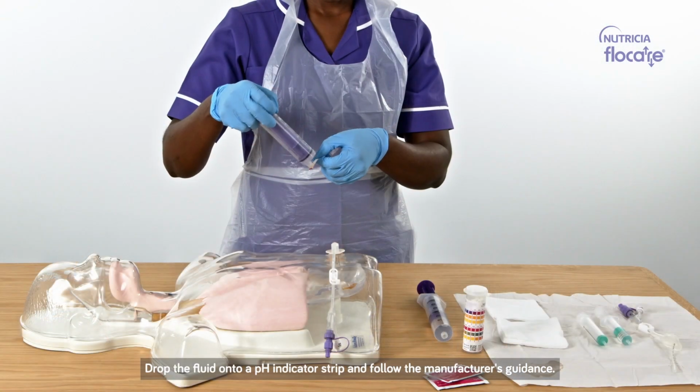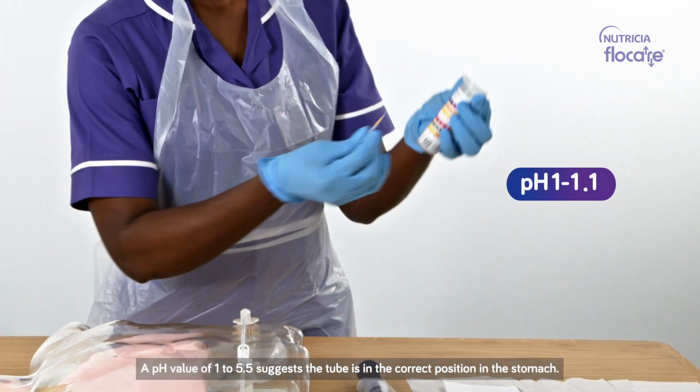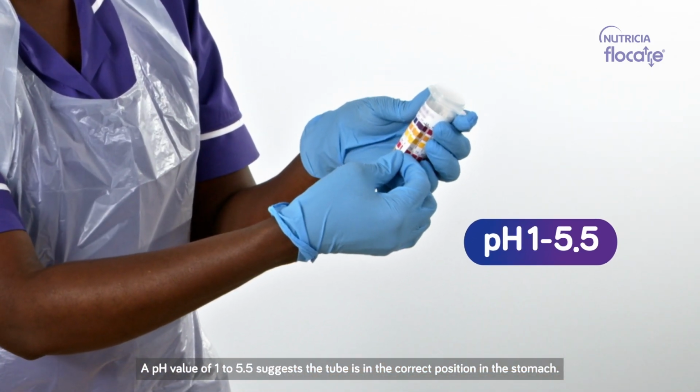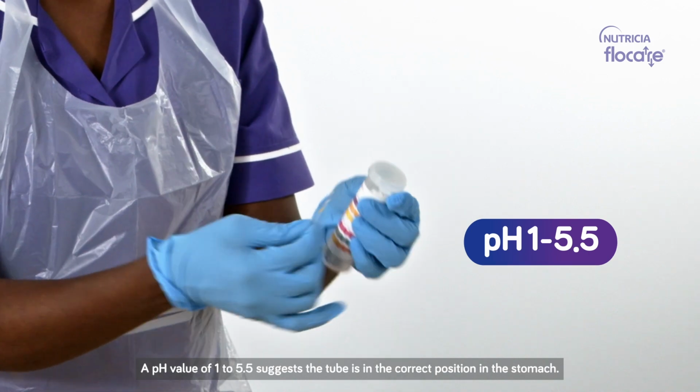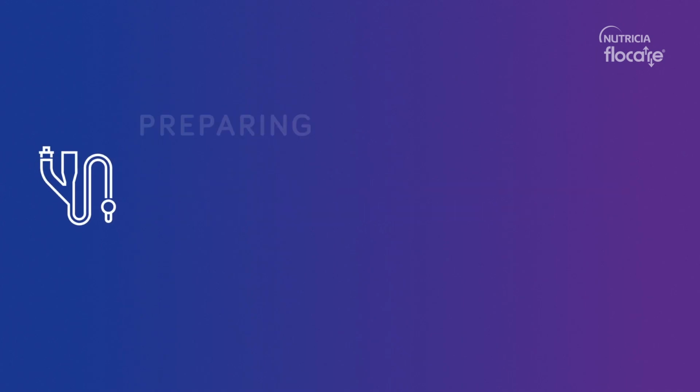Drop the fluid onto a pH indicator strip and follow the manufacturer's guidance. A pH value of 1 to 5.5 suggests the tube is in the correct position in the stomach. If you see a pH value of more than 5.5, do not go ahead with the tube replacement and contact your managing healthcare professional for advice.